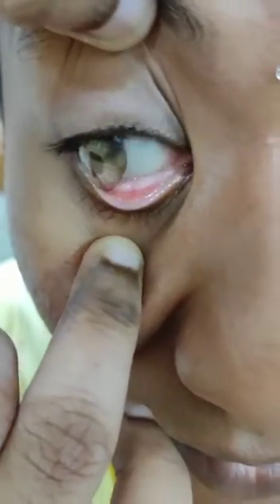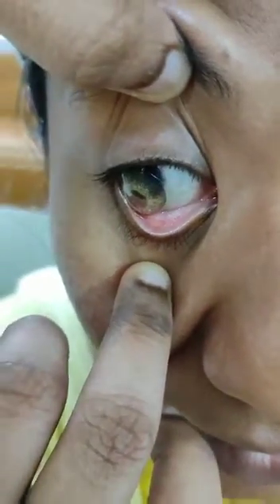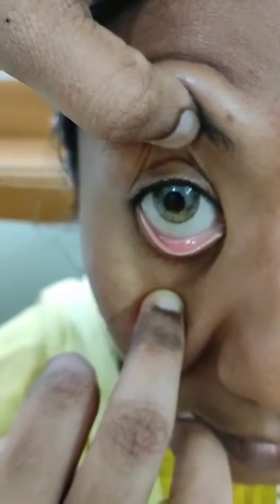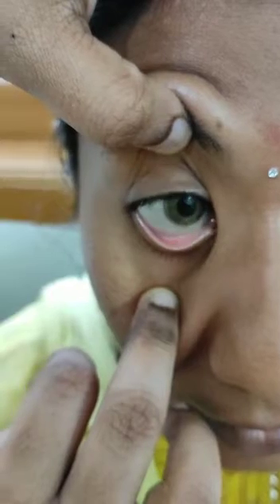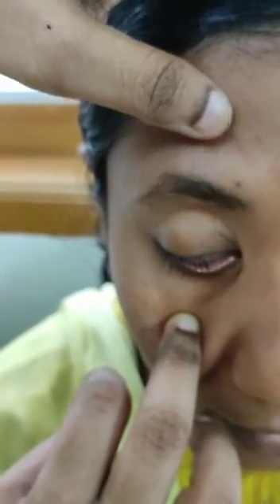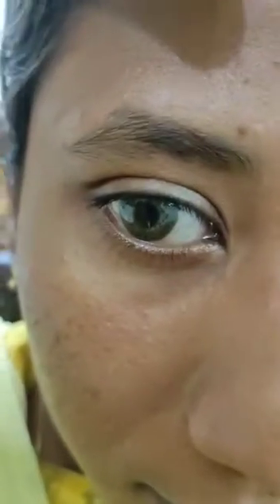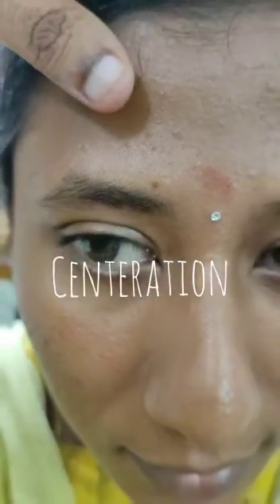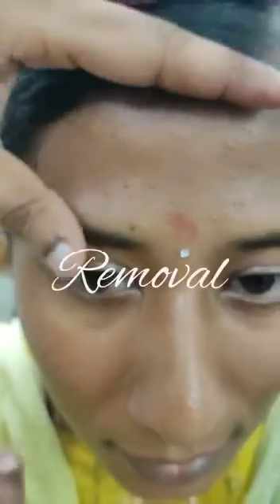Now insert the lens into the patient's eye by telling them to look in the opposite direction. Place it carefully and tell them to rotate their eyes in all directions. Now slowly release your hand from the upper eyelid, tell them to rotate for a second, and check the centration of the lens. Ask the patient if there is any discomfort after wearing the lens.